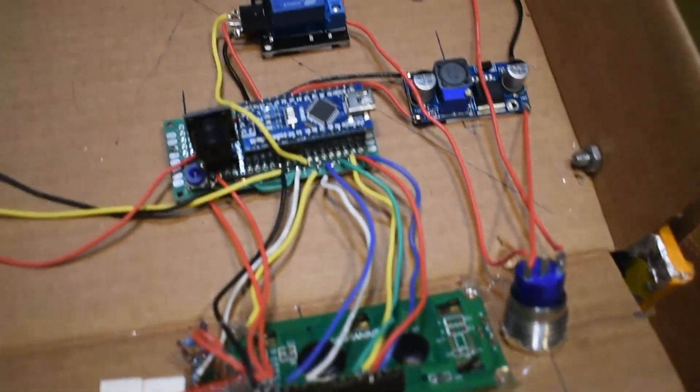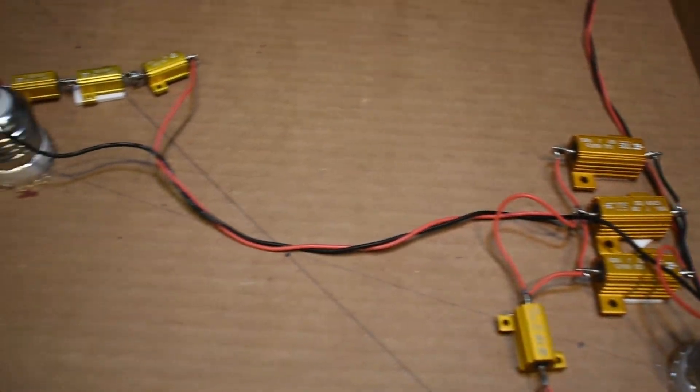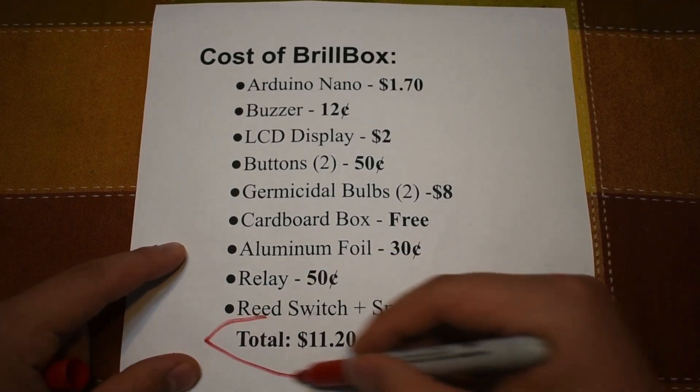The circuitry behind BrillBox is simple. A relay coupled with an Arduino Nano is the main driving component for the UV bulbs. Due to its simplicity, the cost of BrillBox is as low as $12.